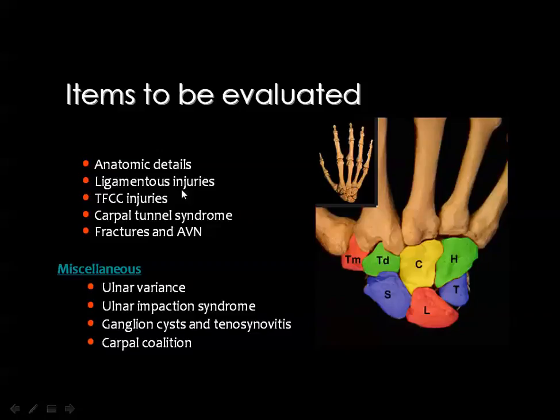Then we'll discuss ligamentous injuries and injuries of the triangular fibrocartilage complex.